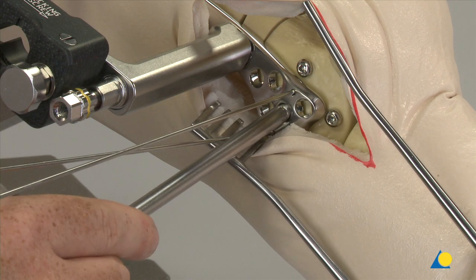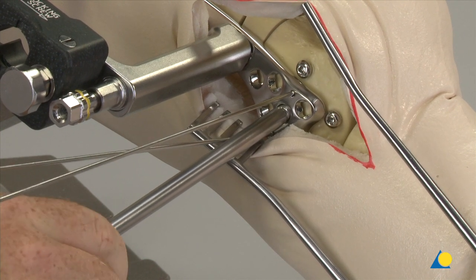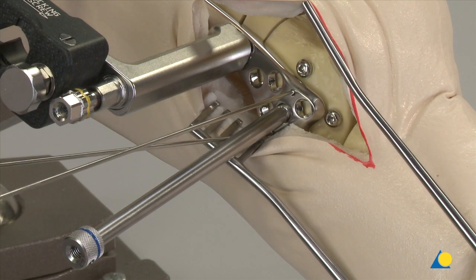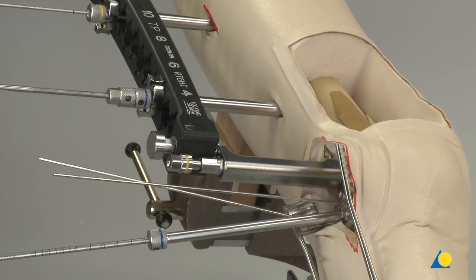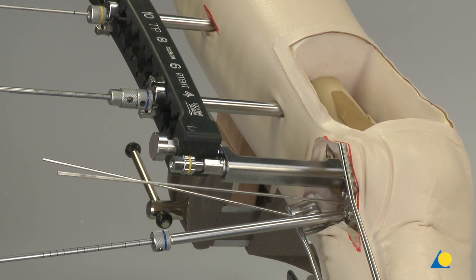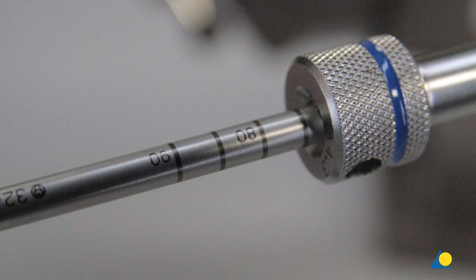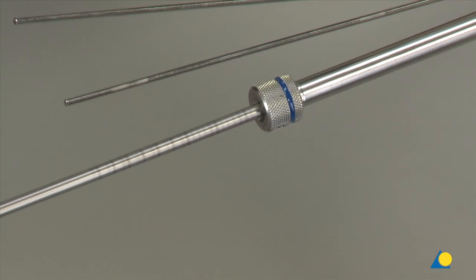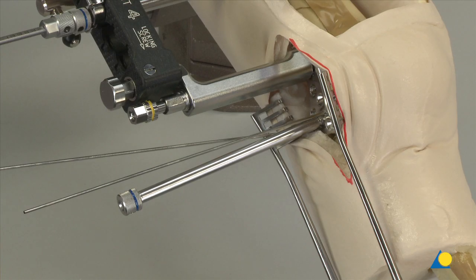Thread the 4.3 mm drill guide into the fixed angle plate hole in the center of the plate head. Insert the drill bit through the drill guide and advance until it reaches the medial wall of the femoral condyle. Read the measurement from the calibrated drill bit. Remove the drill bit and drill guide. The measurement can be checked with the depth gauge.